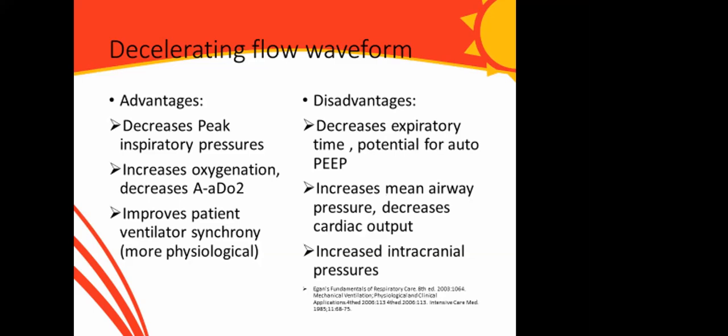The disadvantage is that it decreases expiratory time. So there's a potential for auto-PEEP, or what we call breath stacking, if another breath accumulates before the previous one is fully expelled. So it's called auto-PEEP or breath stacking. They keep building on each other. And obviously that increases intrathoracic pressure and it affects your cardiac output. All right, that is what it means.